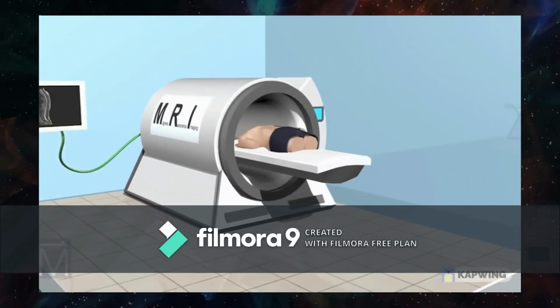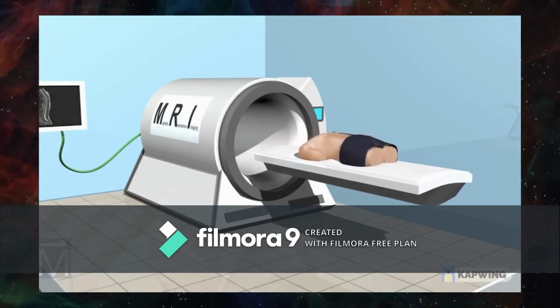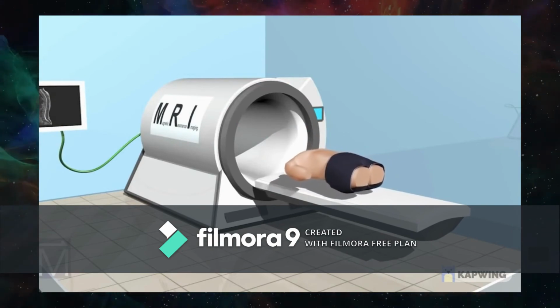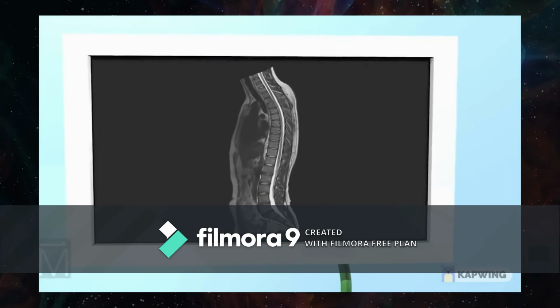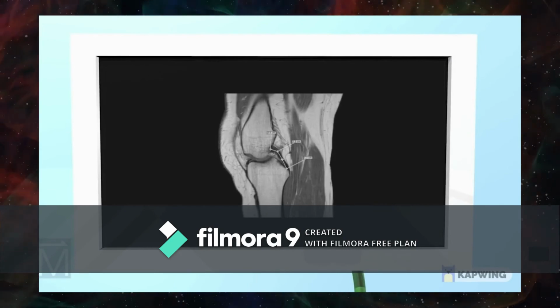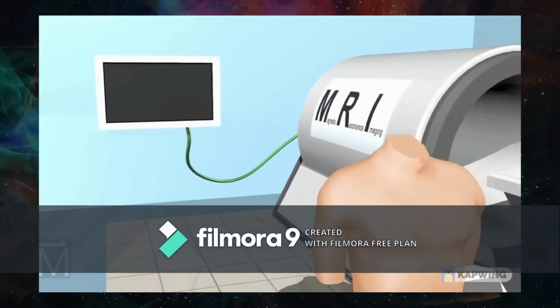The varying signal strengths get translated into various shades of gray, which radiologists recognize as different types of tissue on the scan. MRIs can be used to scan the brain, joints, and other parts of the body in order to highlight abnormalities such as cancer, stroke, broken ligaments, and aneurysms.